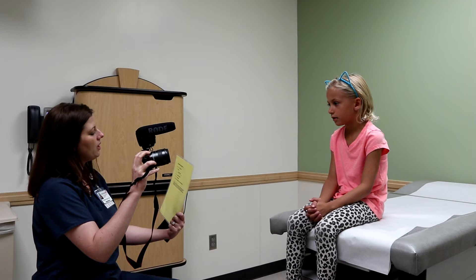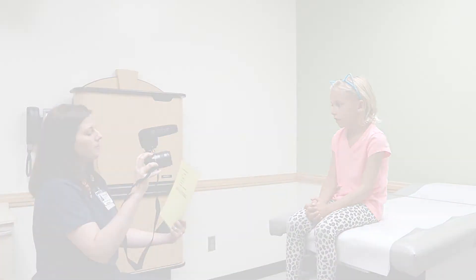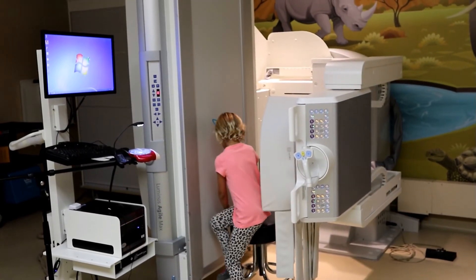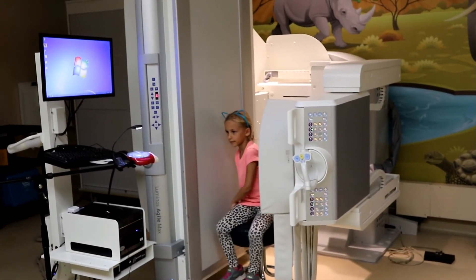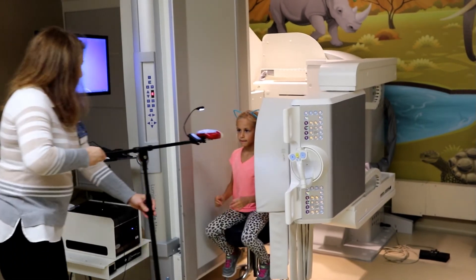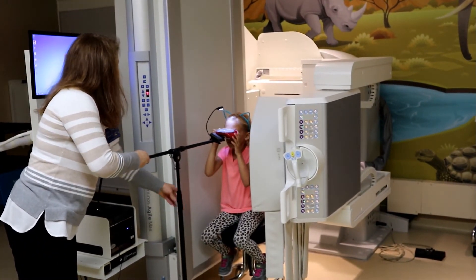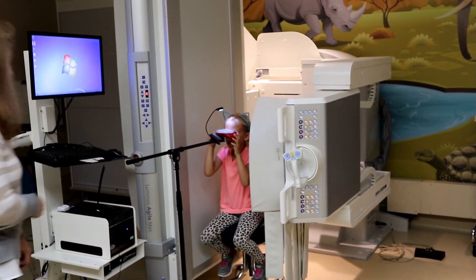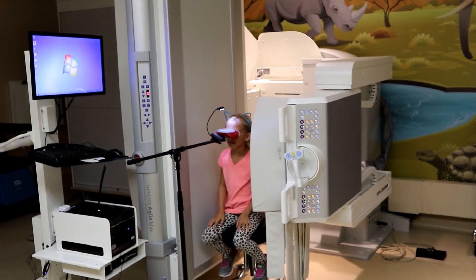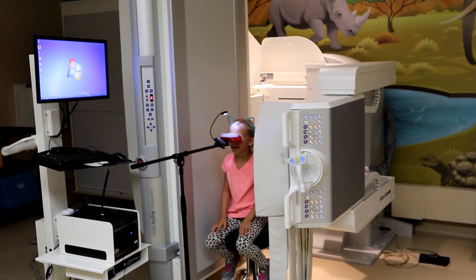This speech imaging consists of two imaging studies. The first is lateral video fluoroscopy. This is an x-ray test in which we look at the palate moving from the side as the child talks. Here you can see a girl looking at some pictures to keep her head still during the study, and the machine that takes the x-ray pictures as she is talking.